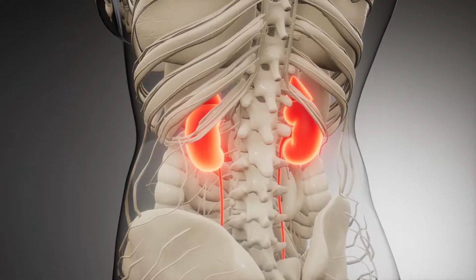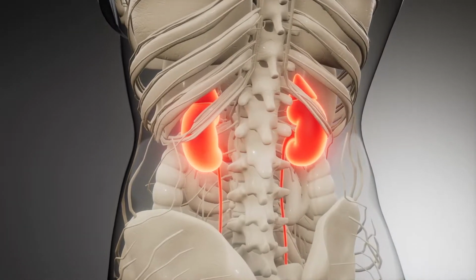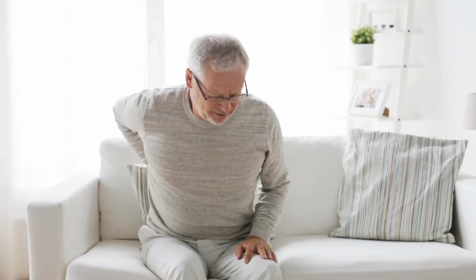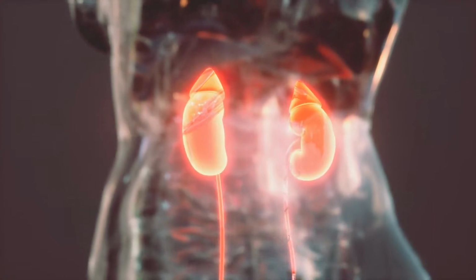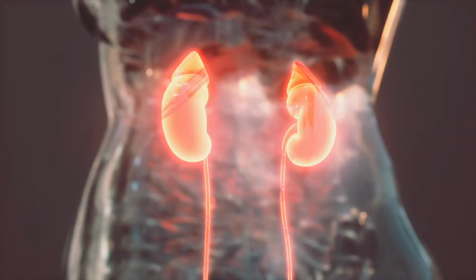Dialysis, in short, is an artificial filtration system for the blood used in times of kidney failure. The most common use for dialysis is actually not an emergency at all. I'm talking about the patient with long-standing kidney problems, chronic if you will.